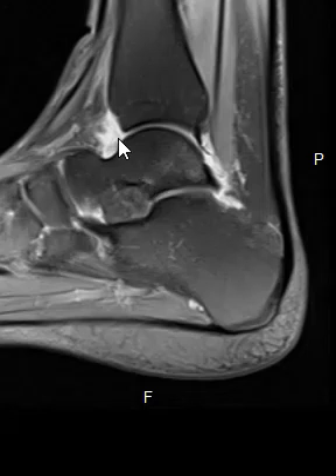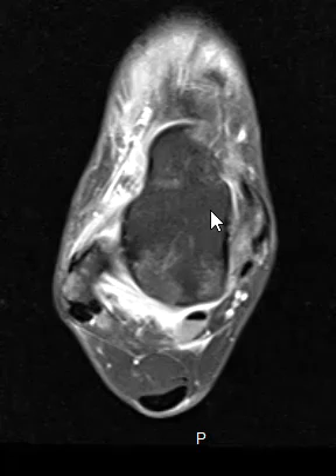We can see white in here — this white stuff is fluid, a joint effusion. So that lets us know that something is going wrong. Now this is a view where we can see the front, back, the outer lateral side, and the medial side.